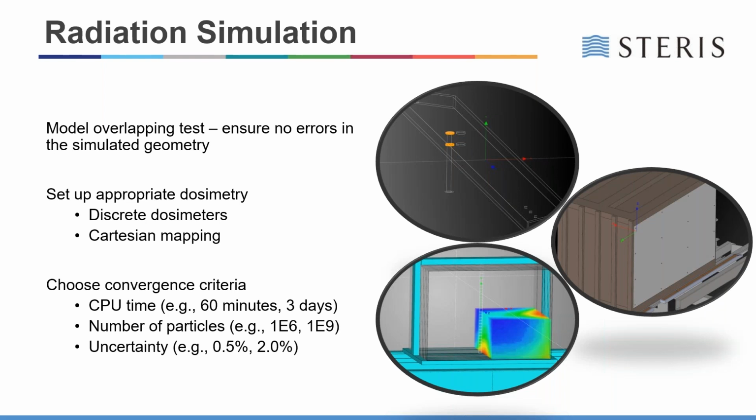Following this setup step, the dosimetry can be replicated in simulation. Here we can see on the image on the right-hand side, a dosimetry system that's simulated to mirror positioning from actual measurements. And this image shows the array of dosimeters placed evenly across the surface of the phantom within the carrier, and such simulated mapping can be directly compared against measurement for benchmarking the simulated model.